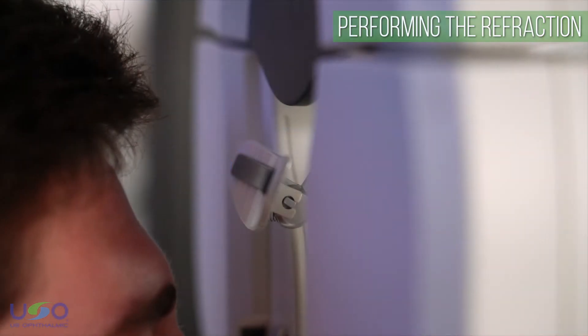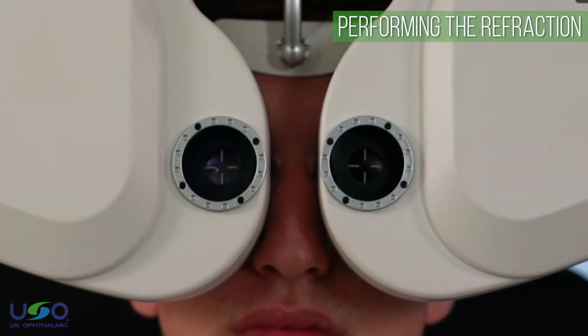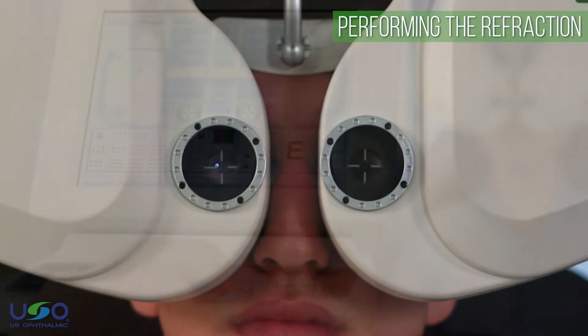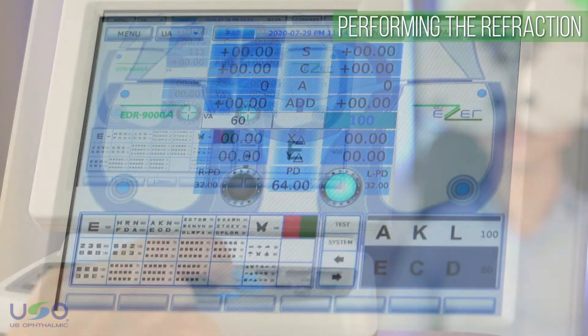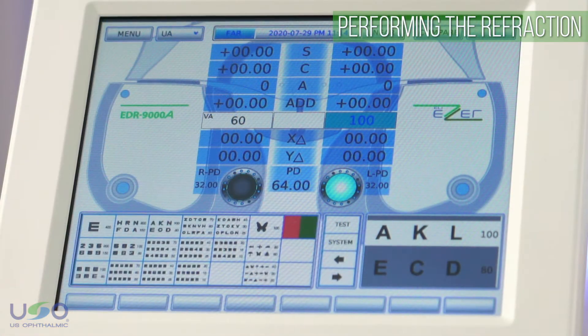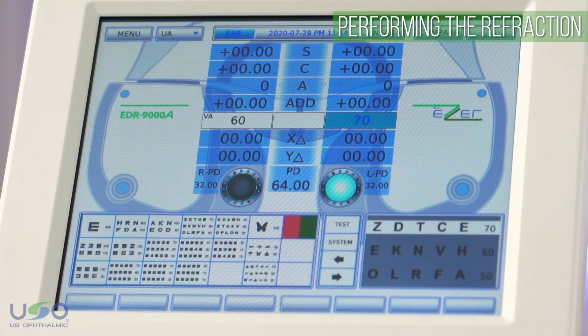This is followed by adjustment of patient positioning and interpupillary distances for accurate visual acuity evaluations. Once the patient's visual acuity has been taken, we can proceed with performing the refraction itself.